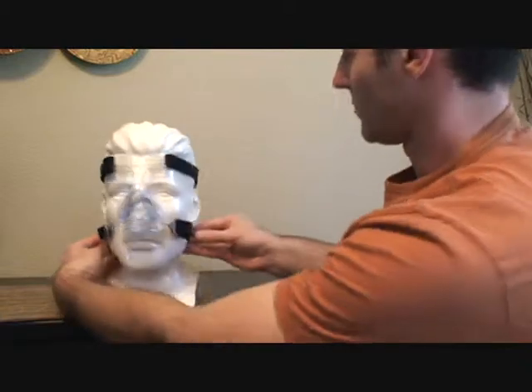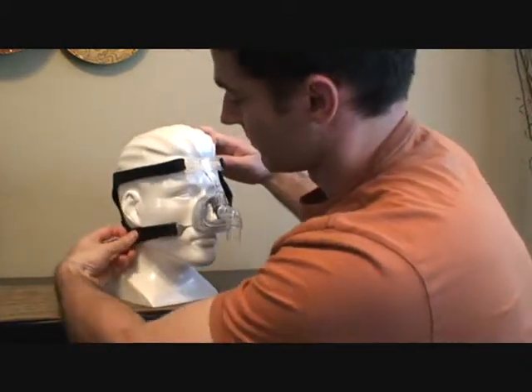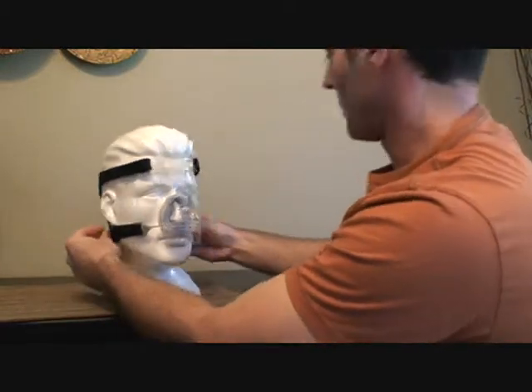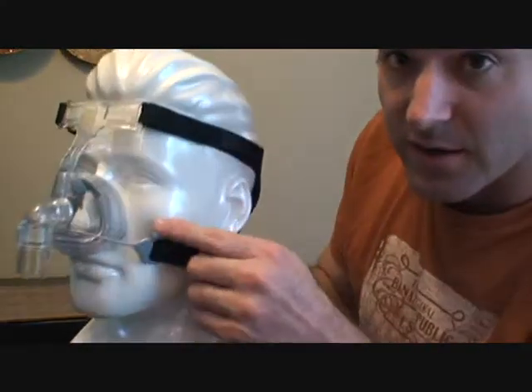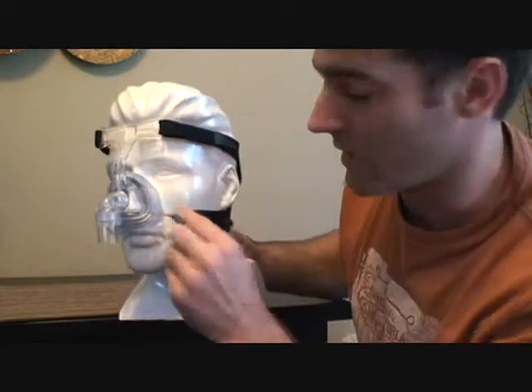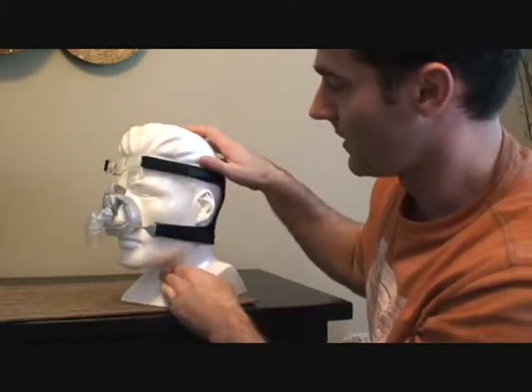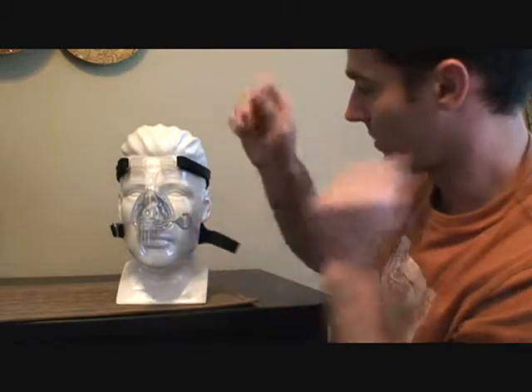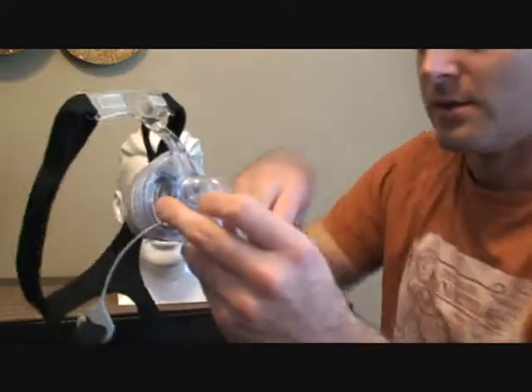You want to pull these apart again on the bottom and tighten. One of the problems with this mask is if you over tighten it too much, this plastic isn't real durable, and so this starts to bend, and then these things just come out on their own. Anyway, as far as getting out of it, just find one side, pull it off like so, and over your head it goes.